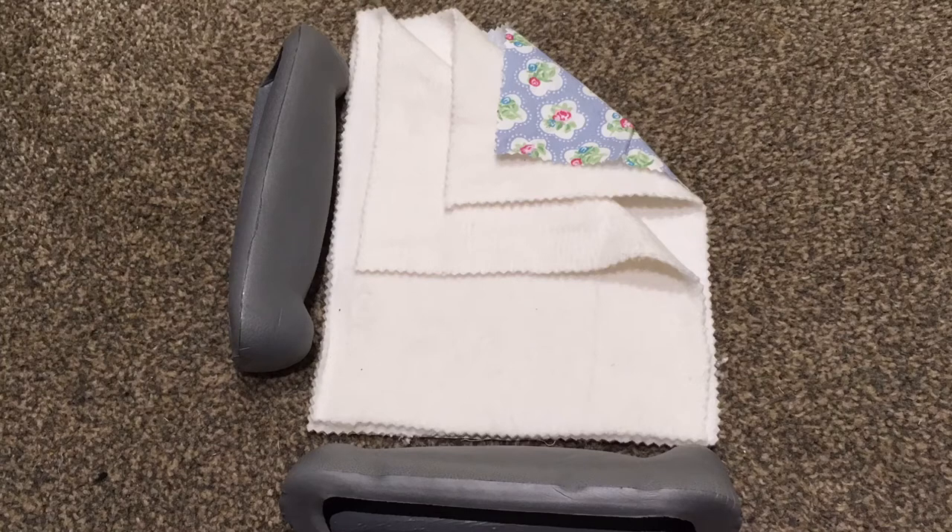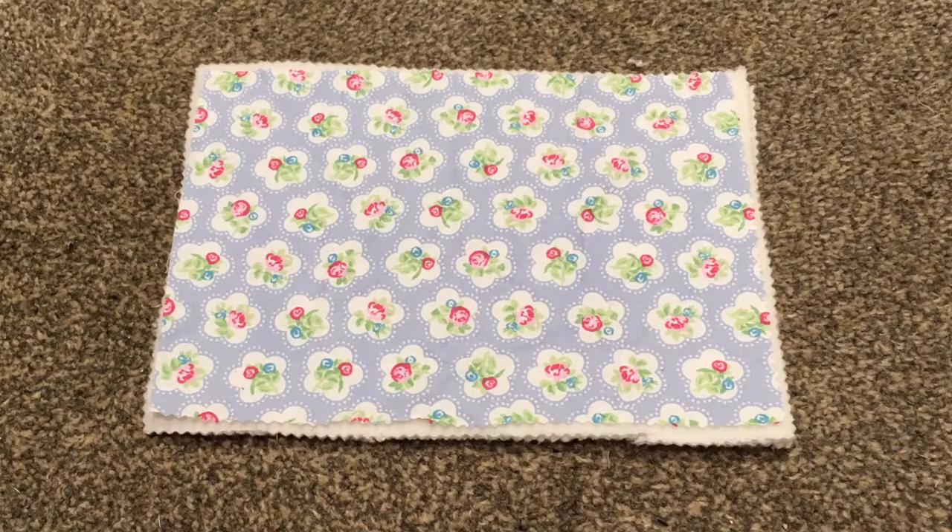Next I measured a rectangle the width of one of the underarm pads and the length of one of the underarm pads plus an inch at either side for seam allowance. I then cut that in one of the top fabric and two rectangles of the polar fleece. I then laid the pieces out with the two layers of polar fleece underneath and then the top layer of fabric with the right side facing up.